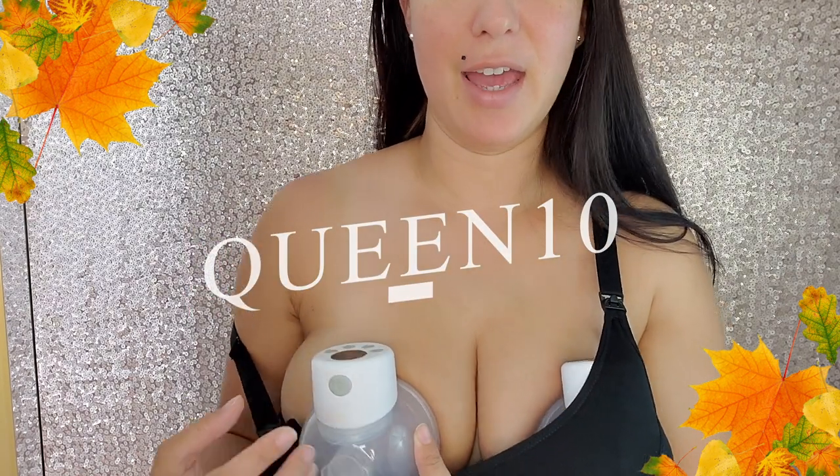It's got an LCD screen, I can turn it on and off. It's got two different modes and nine different settings. The milk collects in this area right here and you have the little LCD screen. This breast pump is by Mom Cozy. Use my code QUEEN10 for 10% off and get this breast pump at a quarter of the price of a regular electric breast pump. It is fantastic. I'll link them down below if you guys are interested.